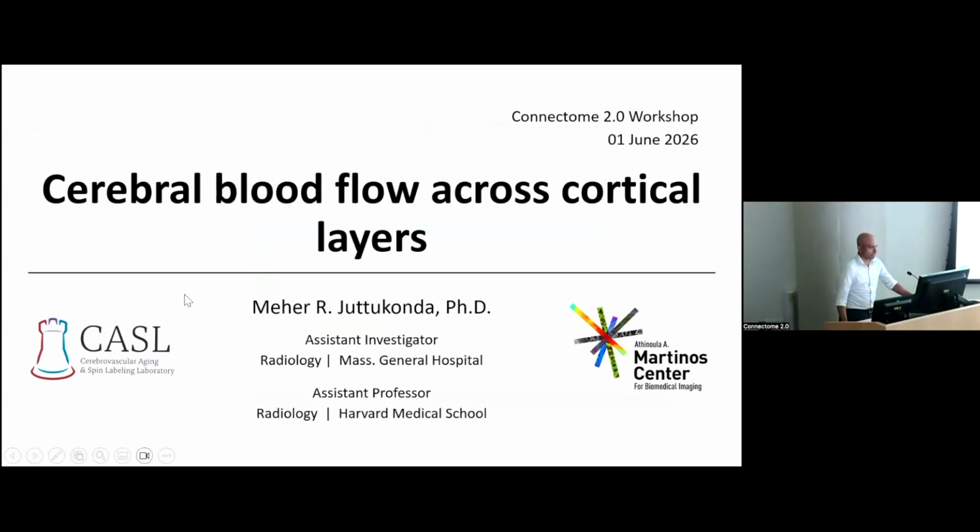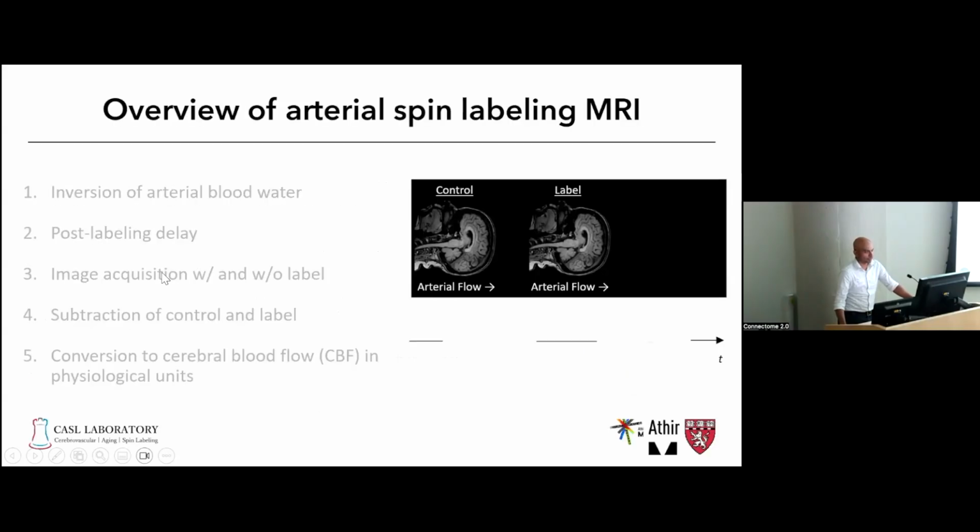Thank you, Susie. So I'll be sharing with you today some of our work, as Susie mentioned, trying to use arterial spin labeling on the Connectome scanner to look at cortical depth dependence of these perfusion signals.